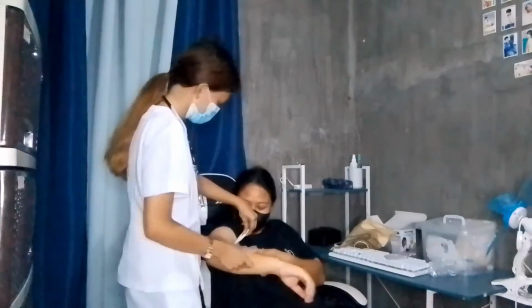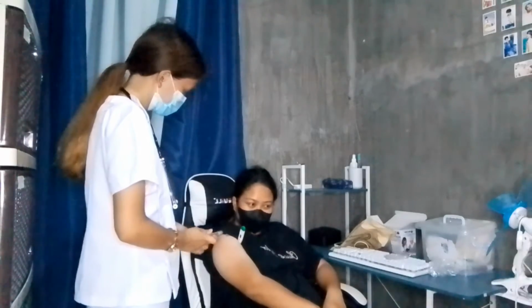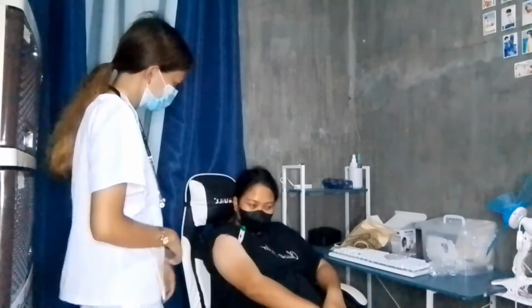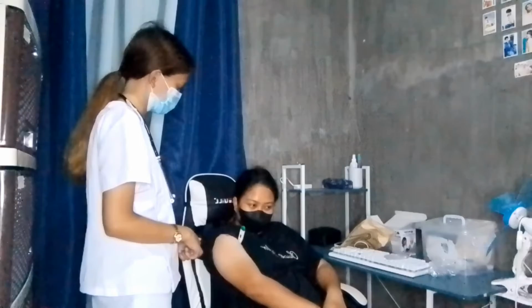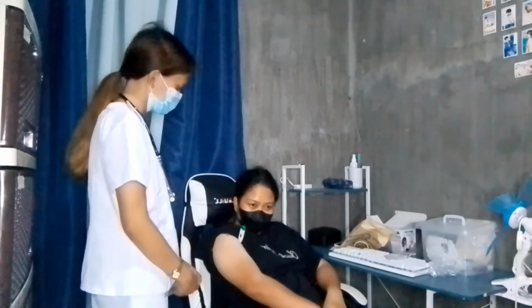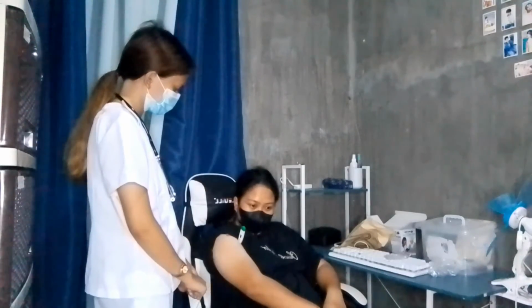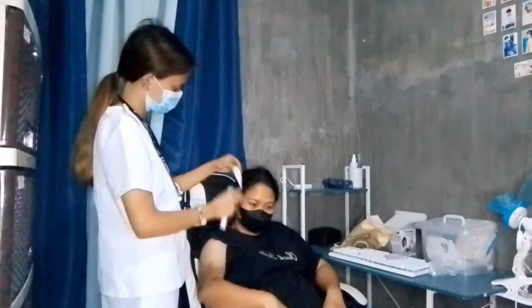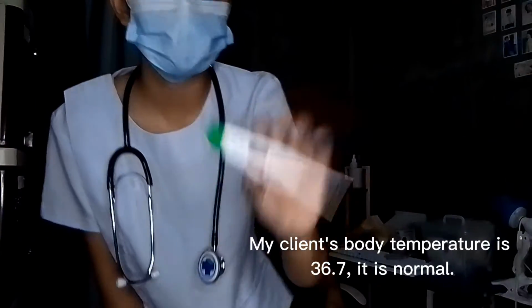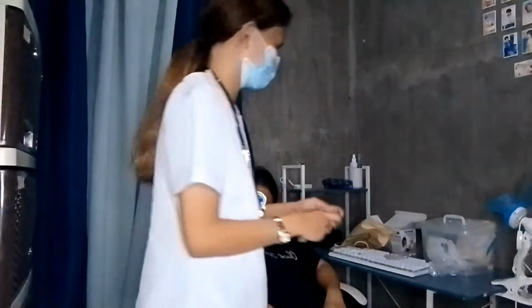Wait the appropriate amount of time. Wipe the thermometer with a tissue if necessary. Read the temperature.